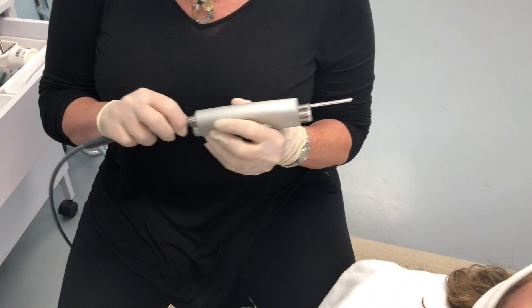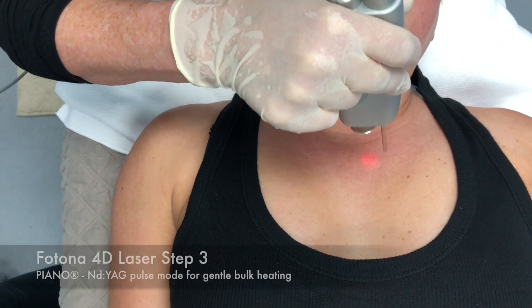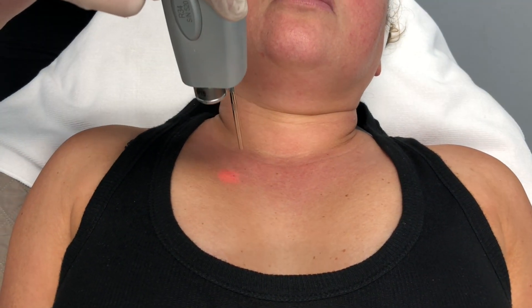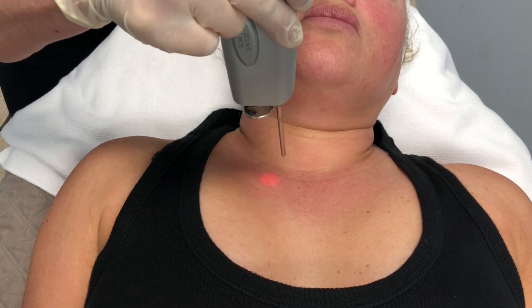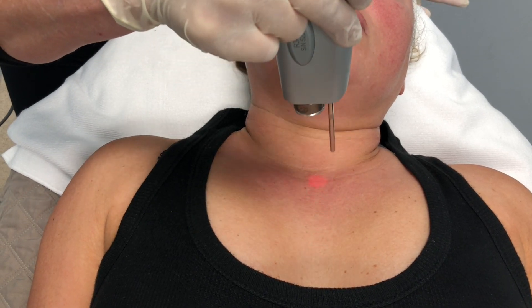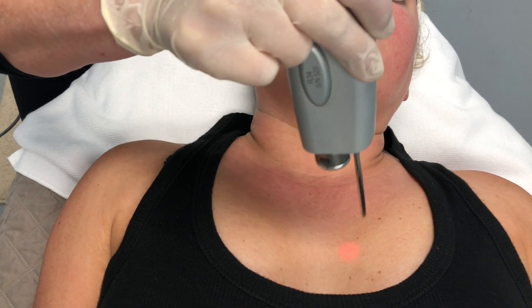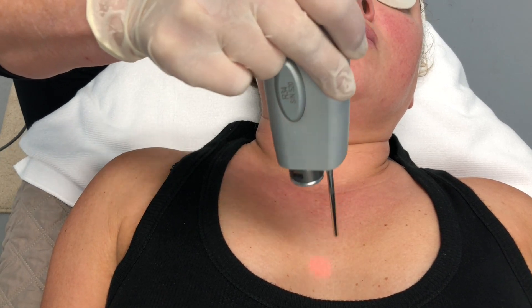The third step is the bulk heating, which is really nice to tap down redness, tighten the skin, and provide a more superficial collagen pull. This is the same type of thing you're doing for fat melting with a tight sculpt, but when you're doing it to a lesser degree, it's just really nice skin tightening — it's not going to melt the fat. As a general rule, about eight passes is just perfect for the anti-aging effect we want without going into fat melting.